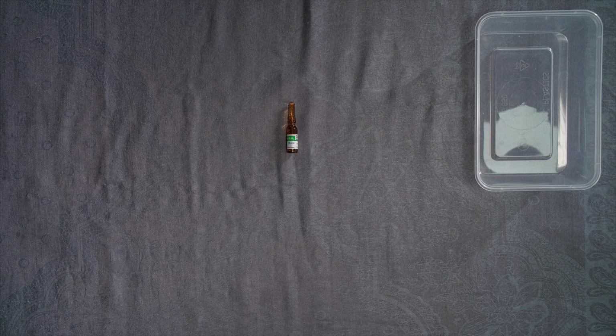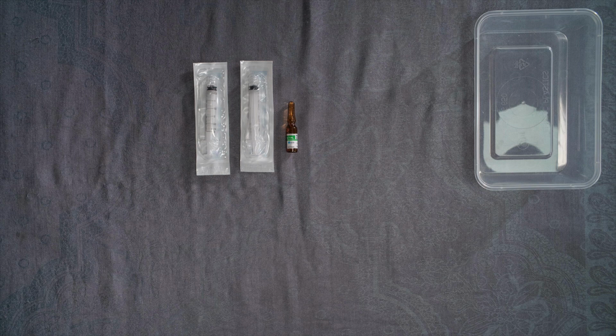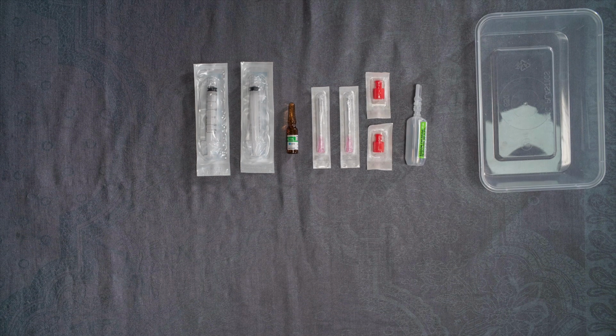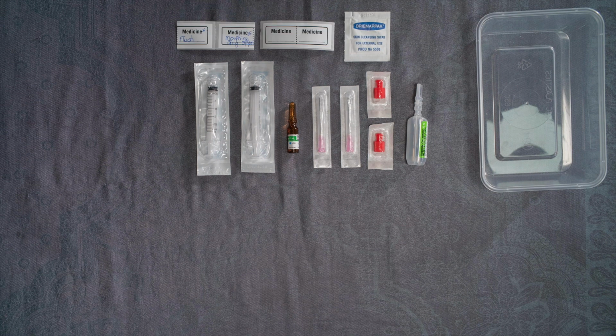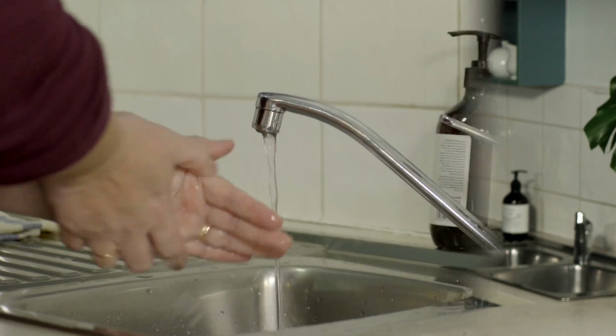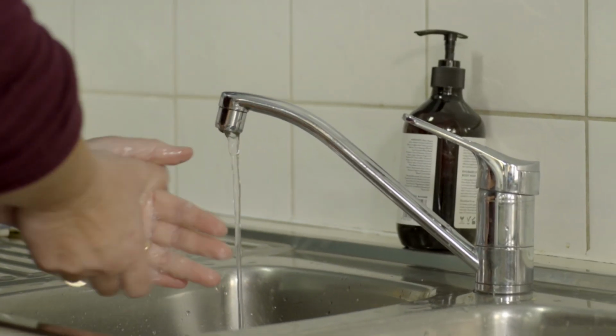The medication, 2 small syringes, 2 blunt drawing up needles, red caps, 1 sodium chloride or water ampule, 1 cleansing wipe, labels, and a sharps container. Before opening any of the equipment, it is important to wash your hands well.